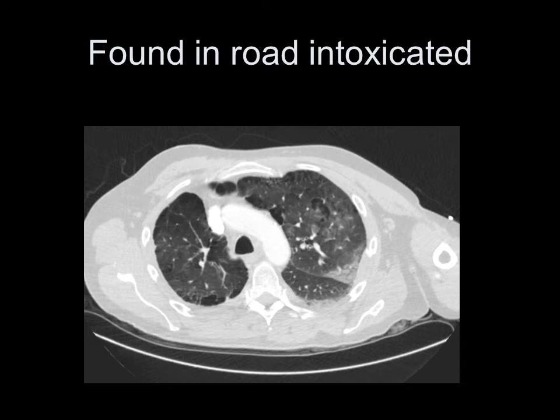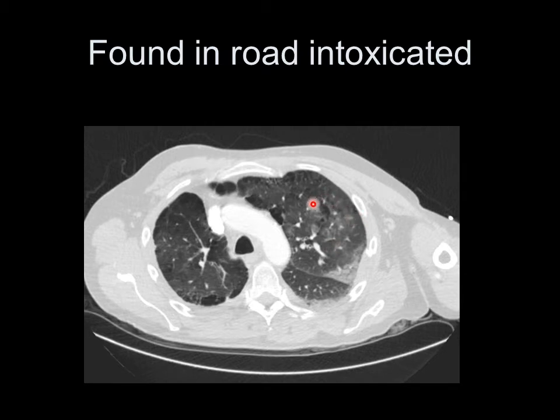Here's another patient with some focal interstitial change — this patient was found in the road. There's an area of interstitial change and we're probably just beginning to see some air bronchograms. Is this consolidation just about to be consolidation? It's hard to know. This patient was quickly discharged and doesn't have any known respiratory issues. Interstitial change is sometimes seen on CT scans close to the pleural and fissure surfaces.